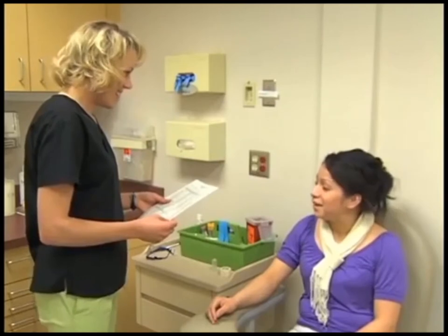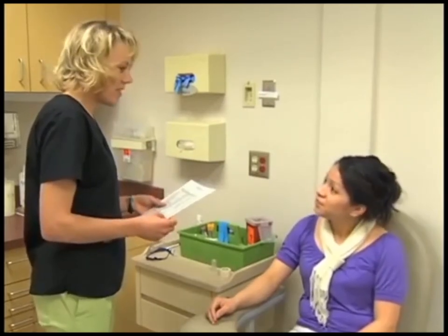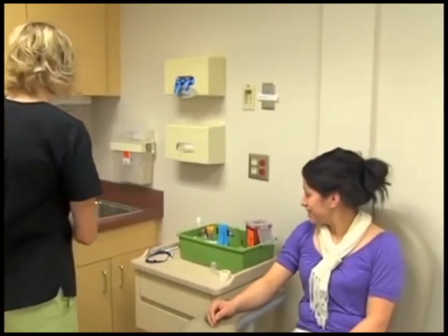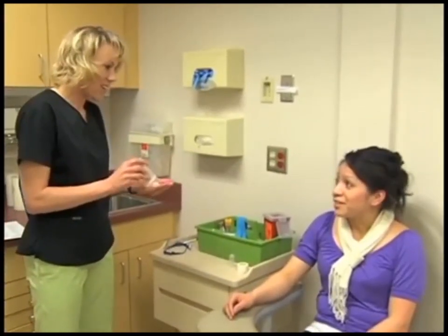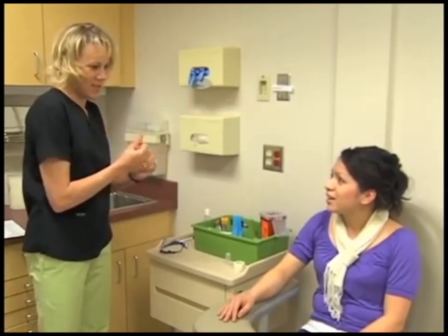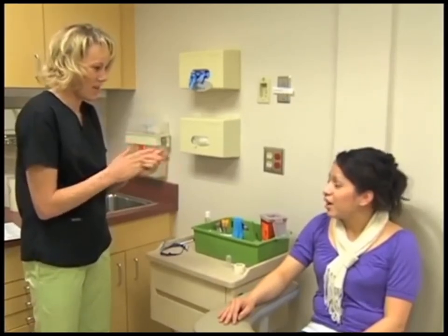Greet the patient and introduce yourself. Identify the patient by asking the patient to state his or her full name and date of birth. It is important to confirm that you have the correct patient to avoid collecting a specimen on the wrong patient. Compare this information to the information in the patient's chart. If the patient was required to prepare for the test with fasting or medication restrictions, determine whether he or she has prepared properly.